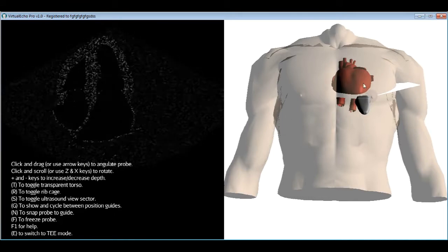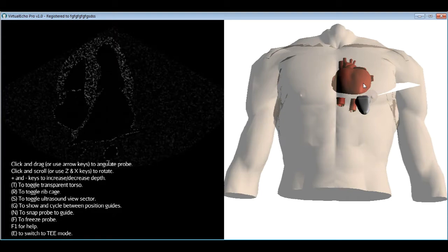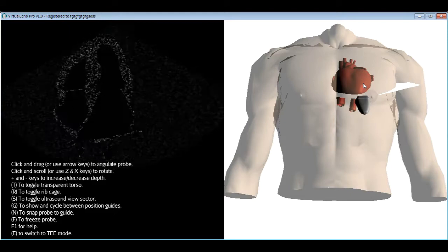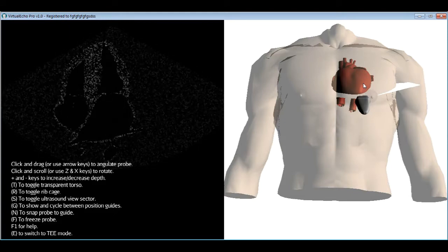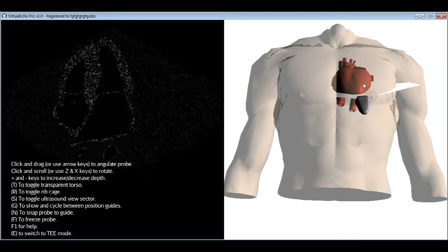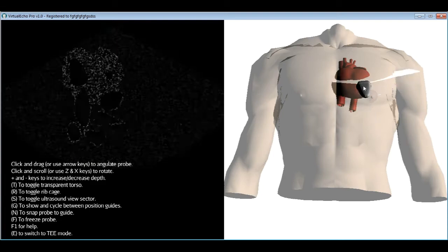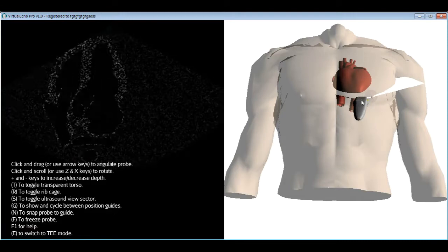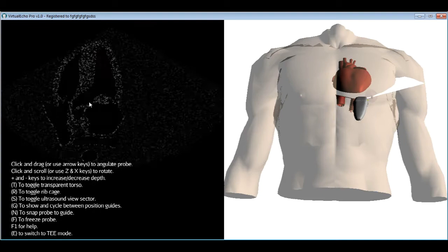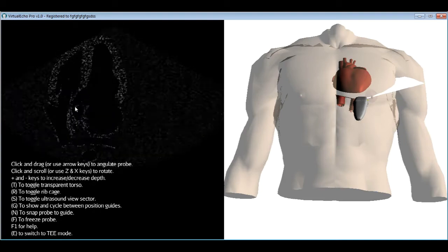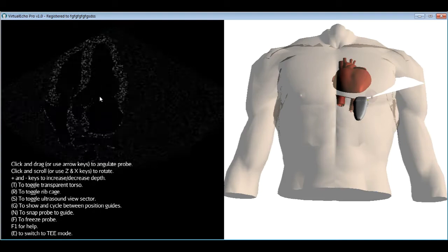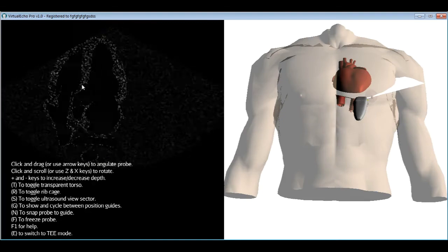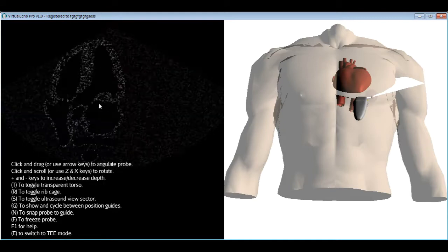The apical five chamber view is called 'five chamber' because the aorta acts as a fifth structure. From the four chamber position, angulating the probe slightly upward reveals the aorta and aortic valve. The aortic valve can then be interrogated by Doppler to assess for stenosis or regurgitation.